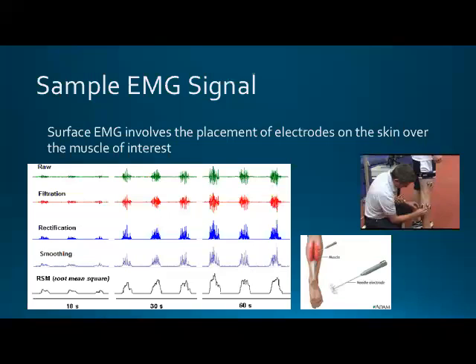When you first put the sensors on and you're measuring any kind of activation, we can pick up noise in hertz. And if it's 60 hertz, that represents environmental noise. So like the noise that comes off the lights, noise that can come off from pipes running underneath the building. So you always check to make sure that environmental noise is eliminated before you actually do a test.